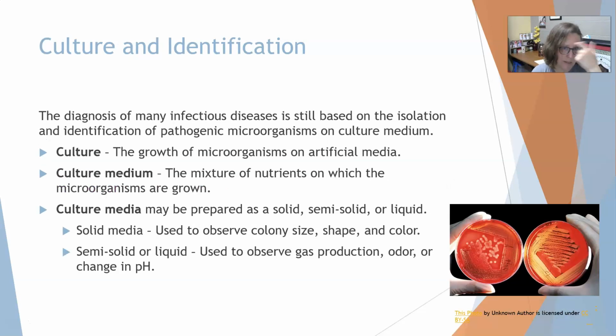The diagnosis of many infectious diseases is still based on the isolation and identification of the pathogenic microorganisms on culture medium. That is the traditional way. It's the way we've been doing it for many years. We have learned to automate this process, and we have added some more molecular techniques and some newer identification techniques, but this is still the basics, and we're going to go over this.